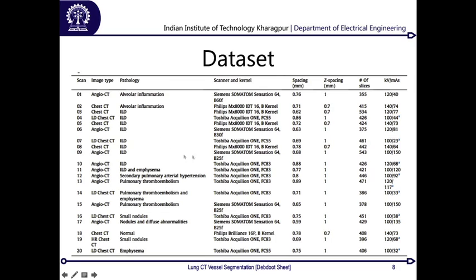But once the challenge got announced, what they did was quite interesting. Since we have this problem of changing across vendors and changing across hospitals, as imaging instruments keep changing, their resolution changes, their operating behavior changes, and as a result all of your image analysis problems which got trained on one domain become a major challenge to make work on another domain. And for medical image analysis software development, this is one major issue which you will have to take care of.